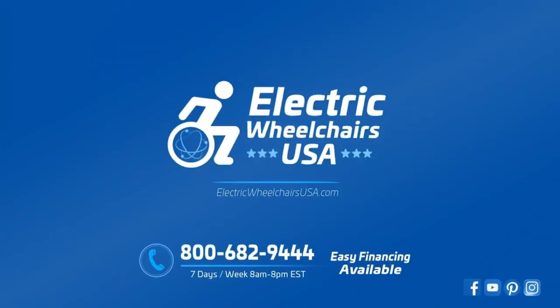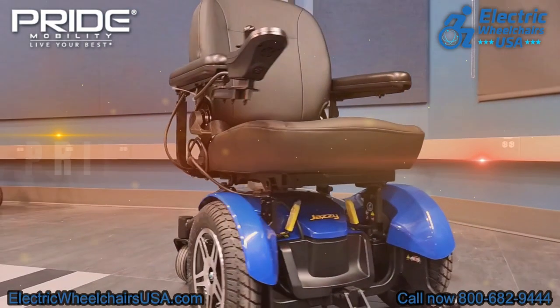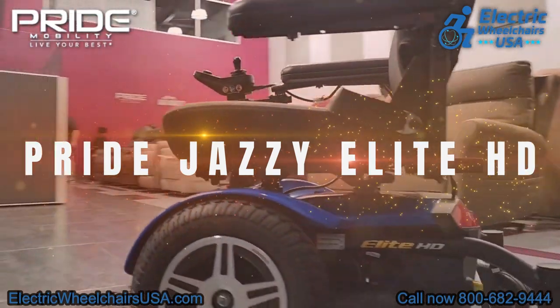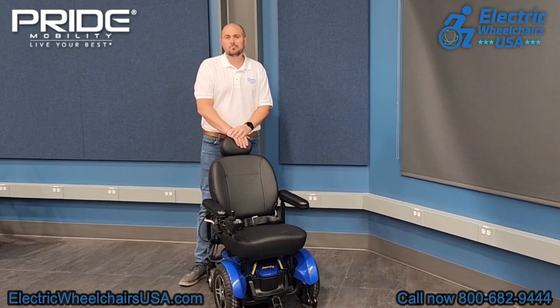Welcome to the Electric Wheelchairs USA Mobility Experts Channel. In this video, we're going to talk about the Pride Jazzy Elite HD Front Wheel Drive Power Wheelchair. This is a great heavy-duty power wheelchair that can support up to 450 pounds of weight, and it can tackle most terrains pretty easily.